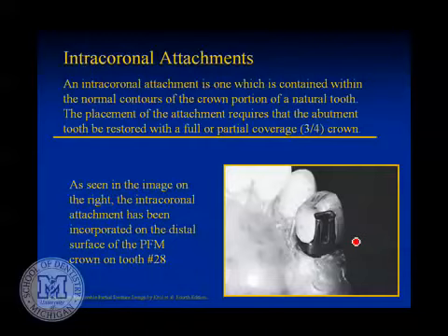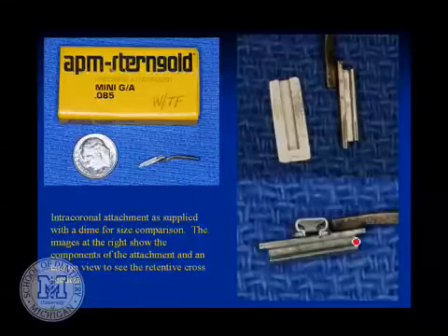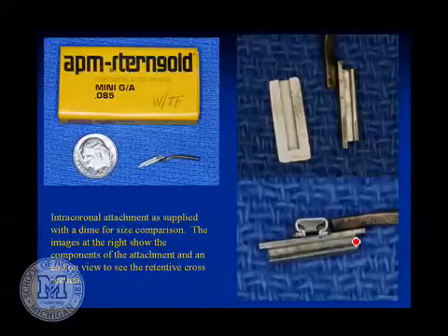Is that impossible to do? Absolutely not. But one of the things to be aware of is how much room do you have axially to fit this thing within the normal confines of the tooth. And here's one of these pre-manufactured attachments that we buy, just shown next to a 10-cent piece to give you a feel for how big these are.